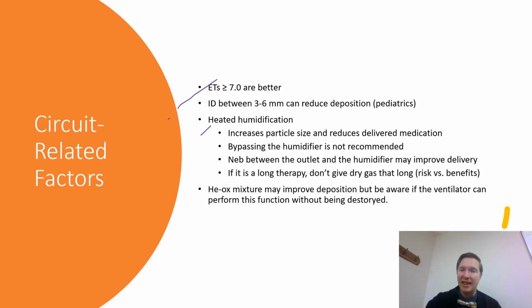Just understand that they might get less medication because we have that heated humidity going on because of what it does to the aerosol size, right? It makes it larger, therefore rains out earlier. Bypassing the humidifier is not recommended for most machines, especially because of forgetting to put it back in place, which could be very disastrous, especially with mucus plugging.